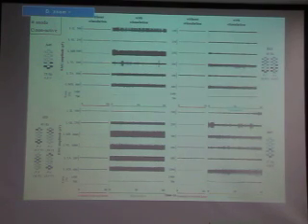And now what I think is interesting from an engineering perspective deals with the stimulation parameters. Here you can see that these four subjects have different electrode configurations. The black are cathodes, the active electrodes, gray are anodes, and white is non-active. You can also see different stimulation frequencies, from 25 to 40, for example, and the stimulation intensity is substantially different, going from 0.6 volts to 9 volts.